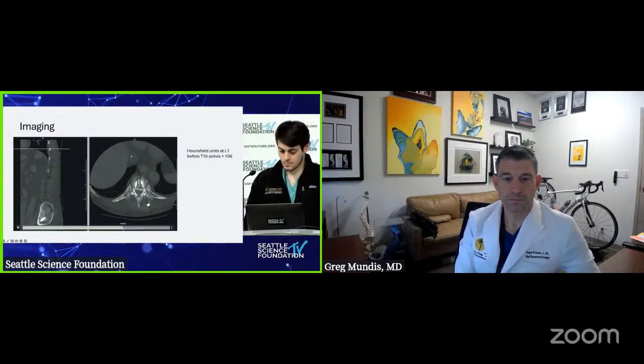So I'm not familiar with this patient. So these discordances or discrepancies between DEXA scans, again, this was a femoral head measurement that I heard here. I'm not familiar with this patient, I must say. So this is discovery for me also. And Hounsfield units are not uncommon. And the regionality of bone density differences in the spine is pretty profound.